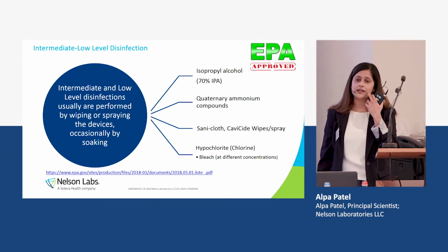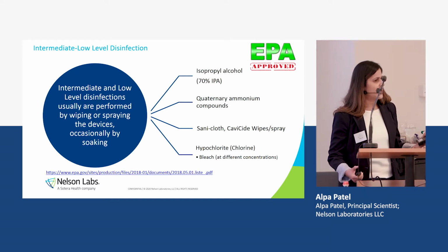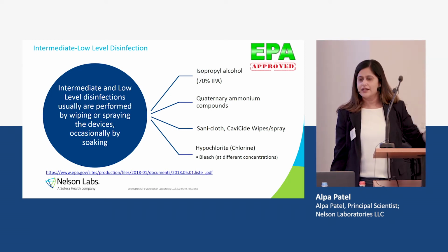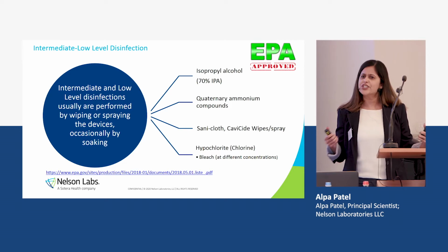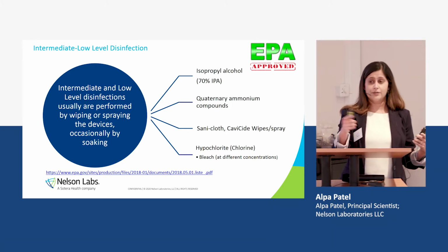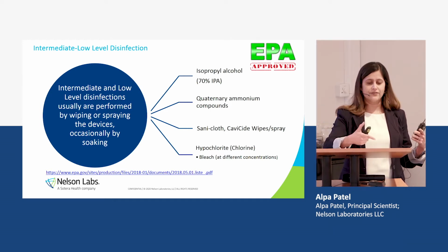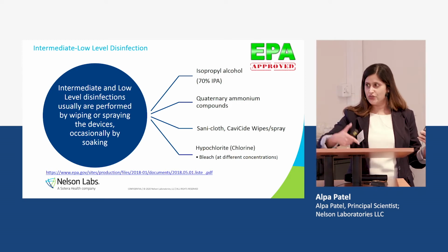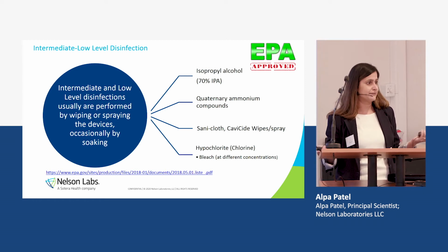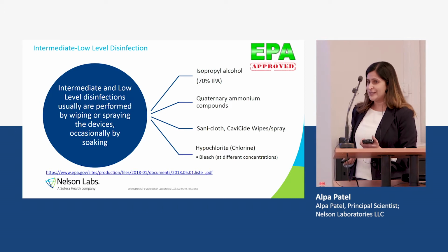And when I've gone to the CSD departments to audit, and we'll ask them, where are your IFUs? They'll be like, oh, it's in the basement. Where the supervisor is, it's in the cabinet. So I'm like, how do you know that you're following these procedures? And how do you know what you're doing? They're like, oh, here's a binder. There's 8 pages in the binder. And they have categorized the device. With lumen devices, you do this. With drills, you do this. With hinges, you do this. And they just have those 8 procedures that they're following. But that's the reality of healthcare facilities.